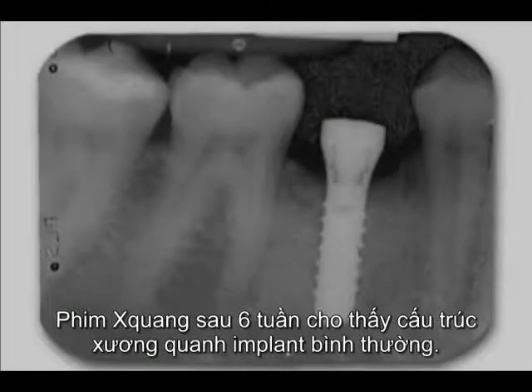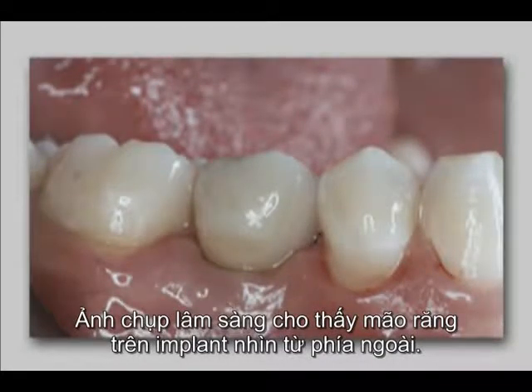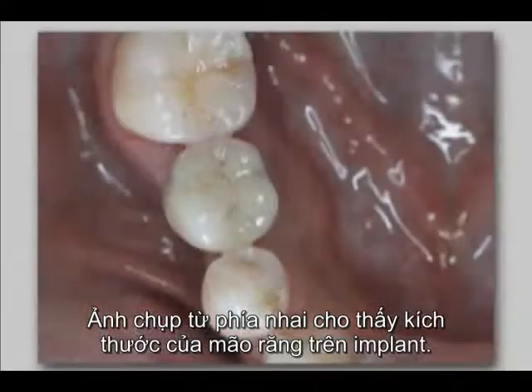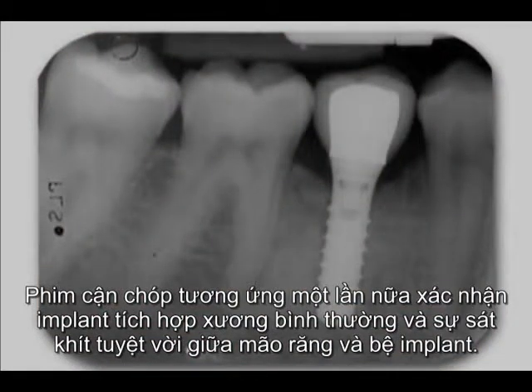The radiograph at 6 weeks shows normal peri-implant bone structures. The clinical view demonstrates the implant-supported crown in the buccal view. The occlusal view shows the dimensions of the implant-supported crown. The corresponding periapical radiograph again confirms normal bone integration of the implant and excellent fidelity between the crown and the implant shoulder.